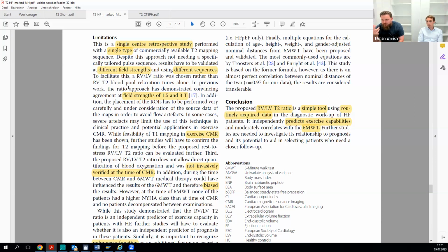It's focused on the myocardium, right? That is the intention of it. But we looked at the very simplistic one-size-fits-all system in the beginning, and it seems to work relatively well if you compare it to the kind of uncertainty that you're having. But totally agree, a sequence that would be more tailored to these relaxation times would definitely be an improvement, right?